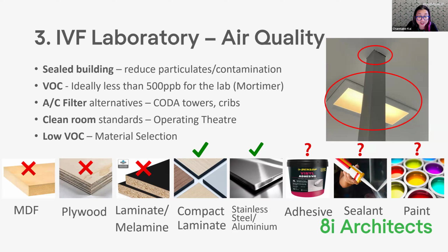You have to make sure that they don't use that. What you can do is build an aluminium frame underneath the stainless steel to support the span. So you can have basically bracing and cross members within the bench framing, and then the stainless steel can sit on that without any rigidity issues.